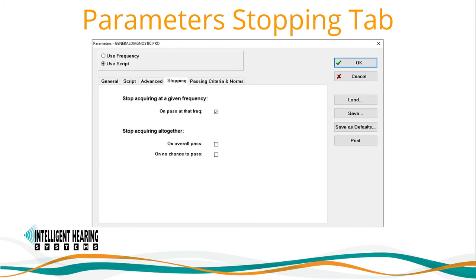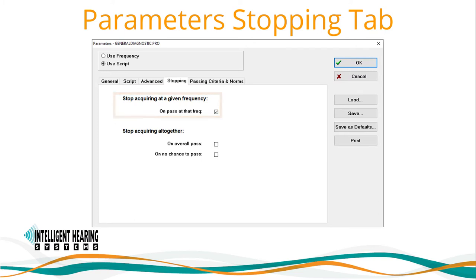The next tab of the parameter menu is the stopping criteria tab. Here you can select to stop acquiring at a given frequency on a pass at that frequency. This option is helpful in speeding up the test if you have selected to use block sizes. You can also select to stop acquiring on an overall pass or no chance to pass, and these decisions are based on user-defined passing criteria.